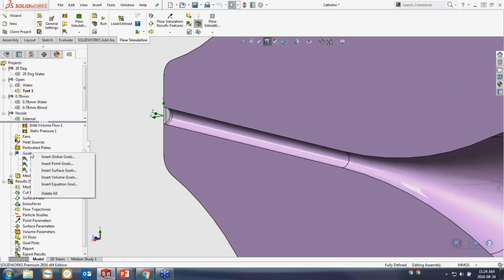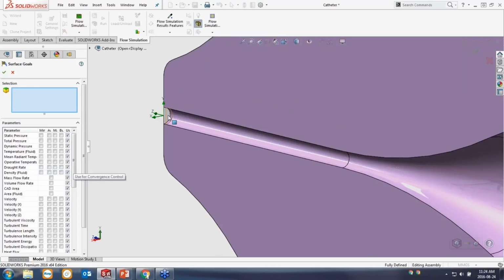We were also concerned about the exit velocity, so I'm going to add one more goal. I'm going to grab that exit face, and I'm going to monitor the velocity of the fluid at that face.